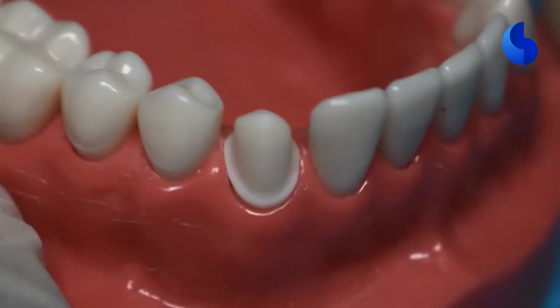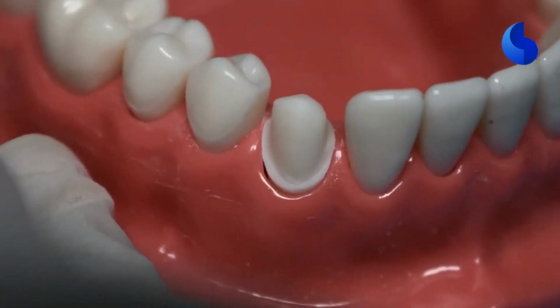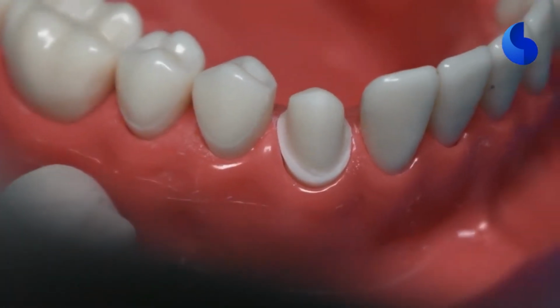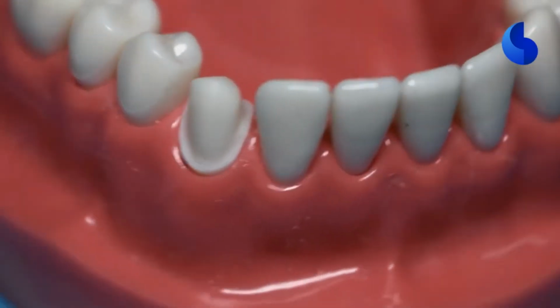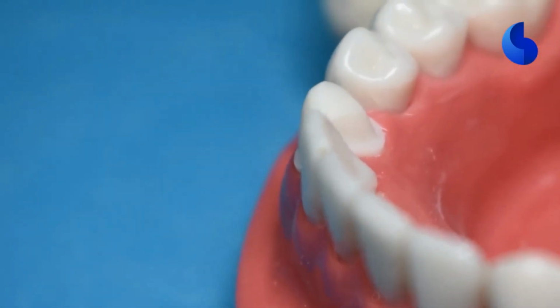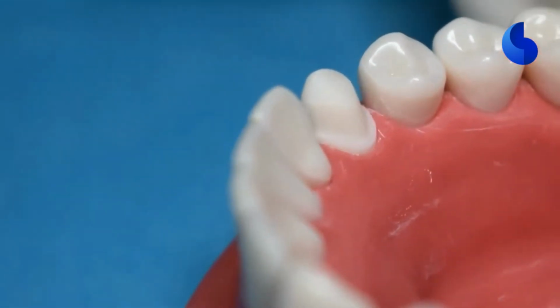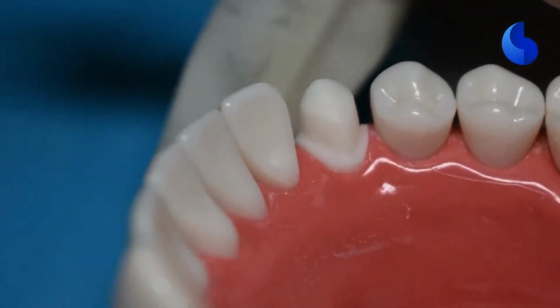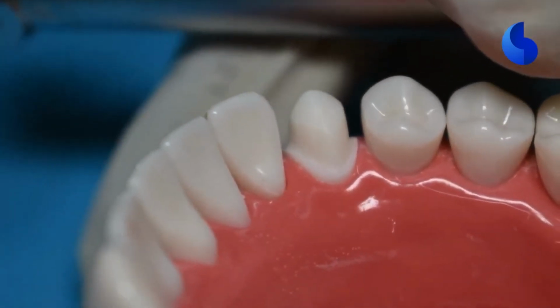And here's our finished product. Take a look at how it has an ideal taper. It's not leaning to one side, it's straight, it's parallel. The margins are supragingival by about 0.5 millimeters. And we've continued to maintain the lingual ridge that we were looking for.